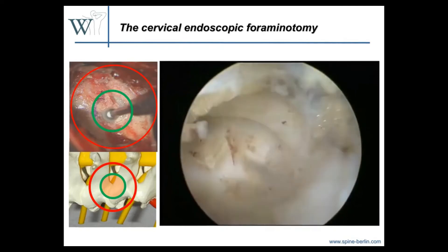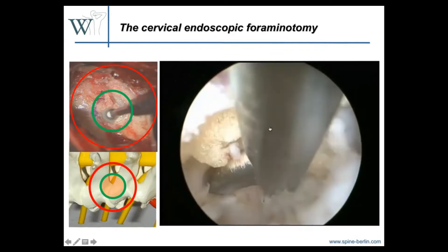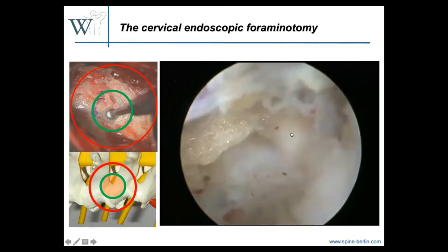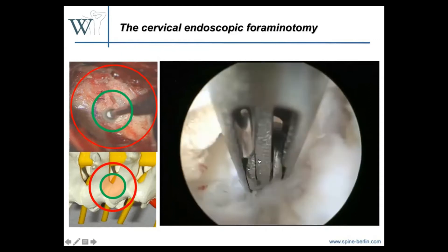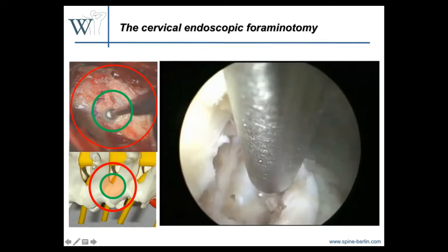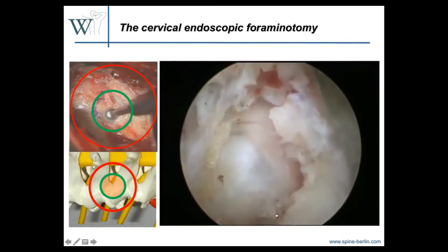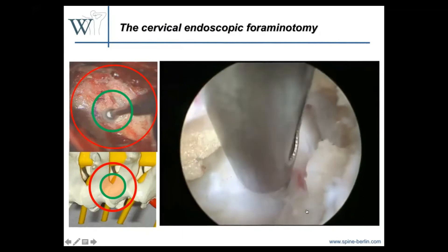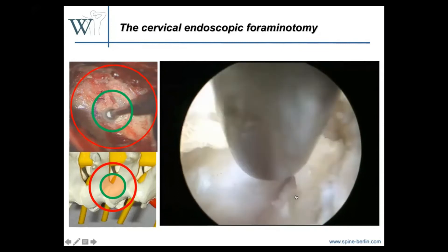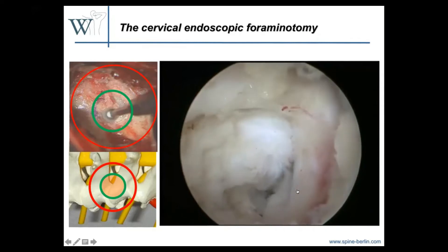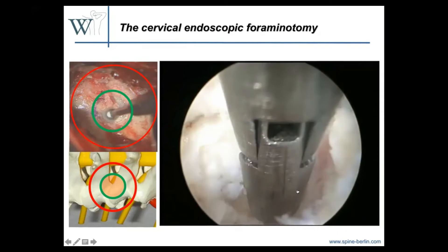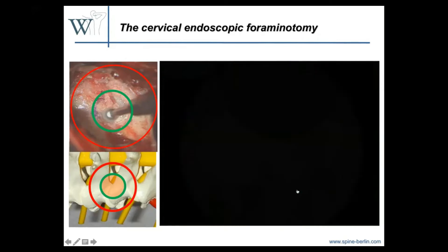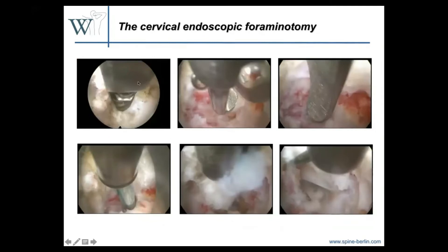You can see the dura from the spinal cord and the nerve root. We always have this 90-degree angle of access from the nerve root, and then you can incise the posterior ligament and resect the disc herniation. You can also decompress the nerve root further by removing a bit more bone if there is some foraminal stenosis. You can check with a hook — I like it very much because sometimes there may be disc herniation under the nerve root, and you can mobilize it with the hook and then remove it.